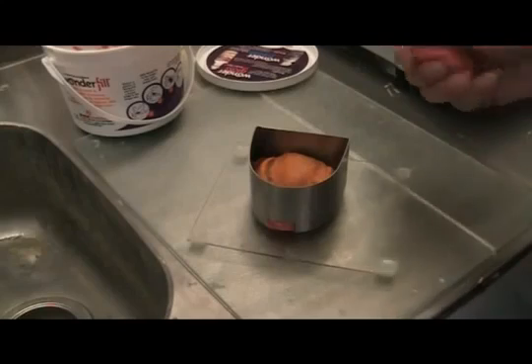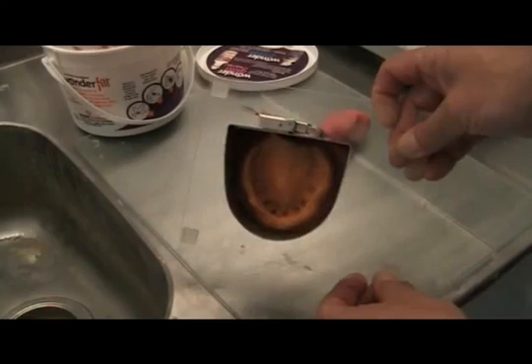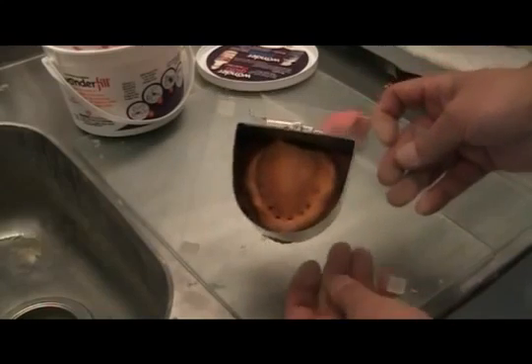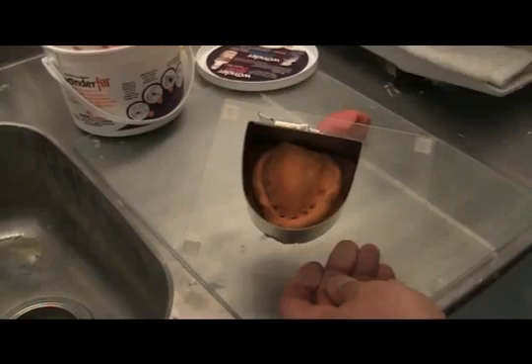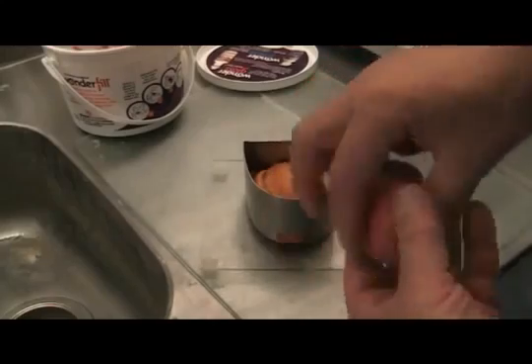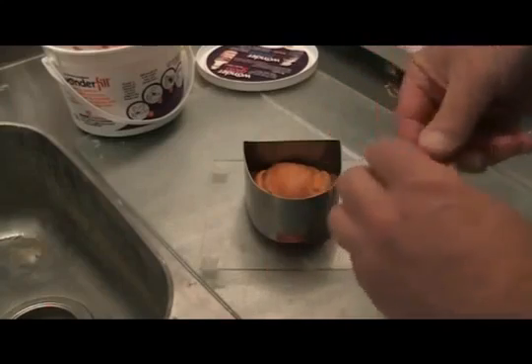I'll take my finger and I'll go around and pull the Wonderfill material off like this. And if I was to show you down in the center, you would see that the Wonderfill material has pulled a little bit away from the impression. It's okay, don't panic. We want to make sure that we have the bottom of the former filled so that we can now take the excess material that we pulled from around the edges, and roll it into little sausages. And what I basically do is I roll it out and place it around the periphery very quickly.